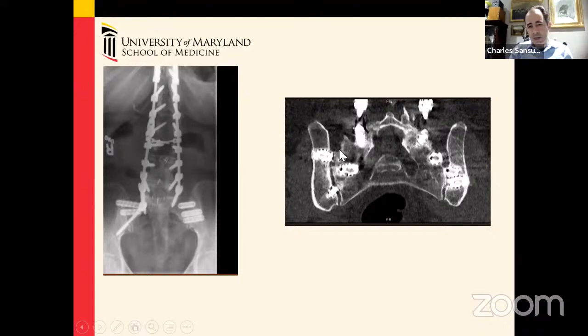These screws on the right were placed first — the initial extension of the construct with a pelvic screw to serve as a stabilizing entity on the right side, because she had right-greater-than-left SI joint pain. She then developed left-side pain, requiring two screws placed on that side, and developed persistent pain. An additional screw was added. She required multiple additional fixations, ultimately culminating in a non-union.